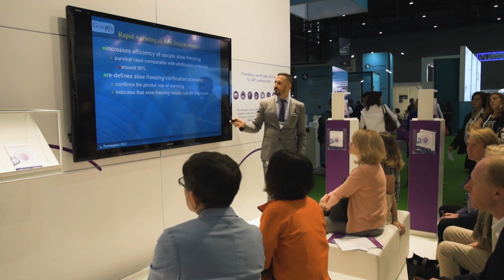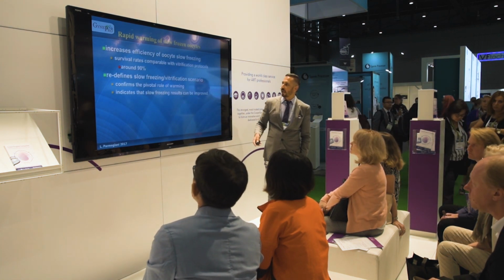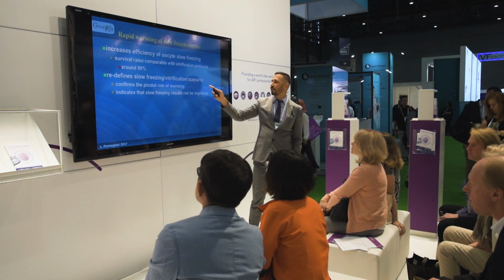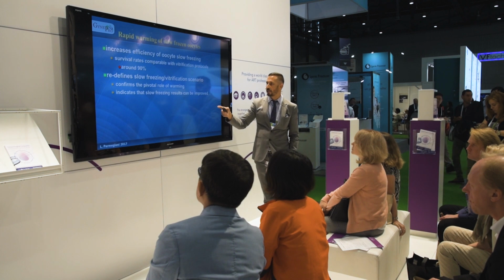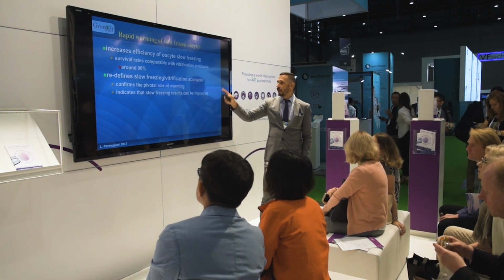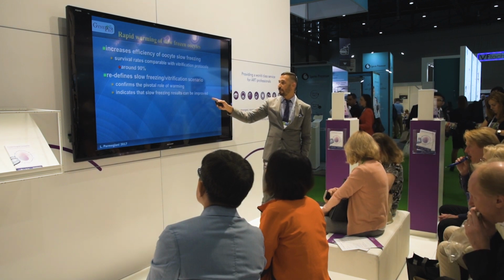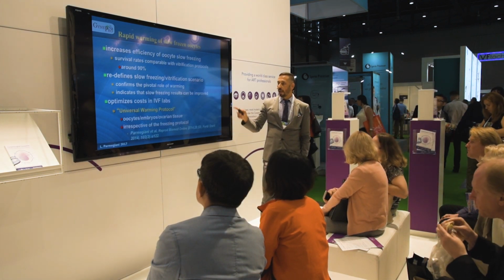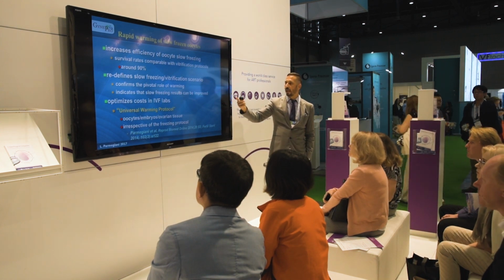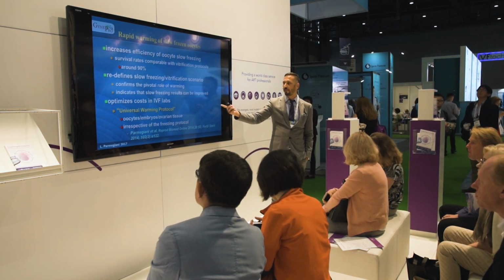So, after this pilot study, we observed that it is possible to redefine the scenario between slow freezing and vitrification, confirming the pivotal role of warming, indicating that slow freezing results can be improved. But most of all, we figured that this protocol can optimize costs in the IVF lab.